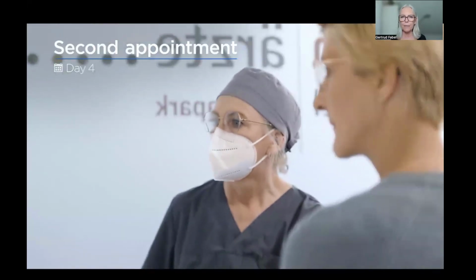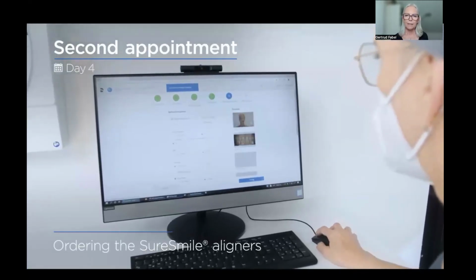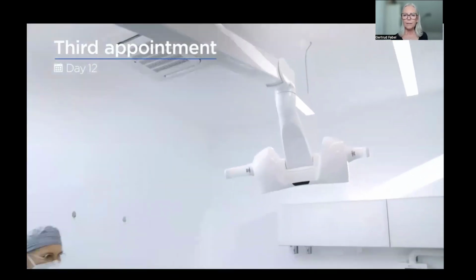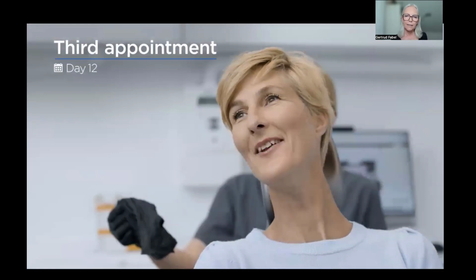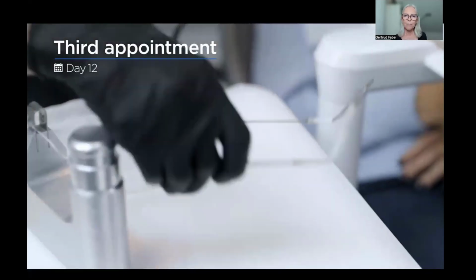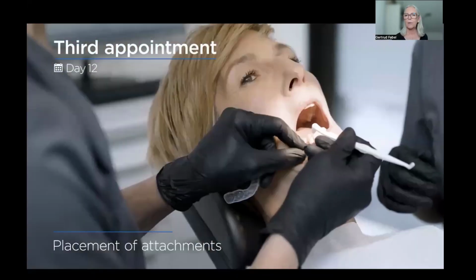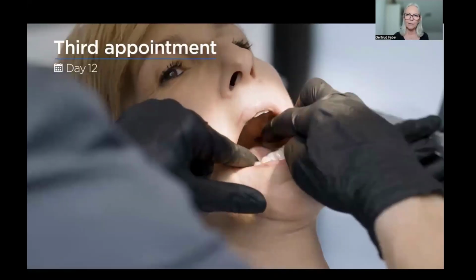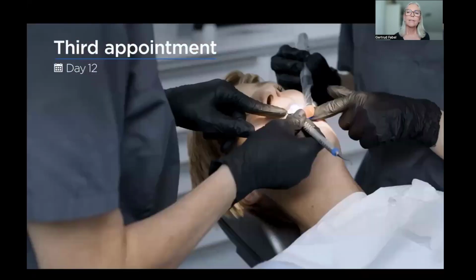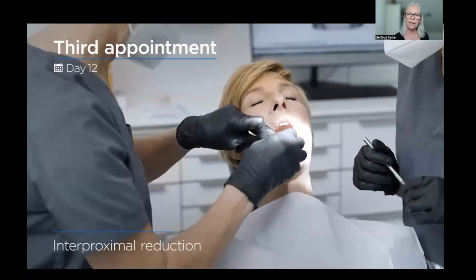In case of agreement, I can order the aligners. I make my file ready to load up. And when the aligners are delivered, we have a little longer appointment, about 45 to 60 minutes, because we have to place the attachments. We have to try in the aligners. We have to slice.